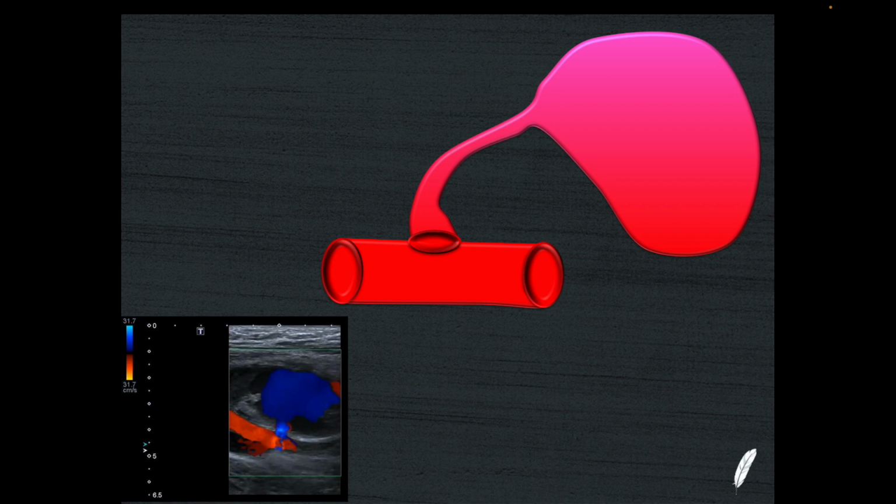Now on the video down here you can see beautifully how we've got a femoral artery here, and it's being punctured during an angiographic Seldinger technique, and then as the large bore needle has been removed from the vessel wall, it's left a leak, and we have a very short neck, and this is emptying into this large sac. So this is exactly what we're seeing here on the schematic.